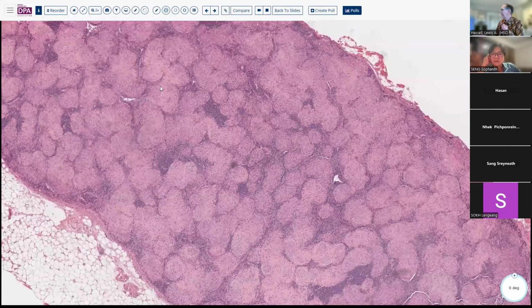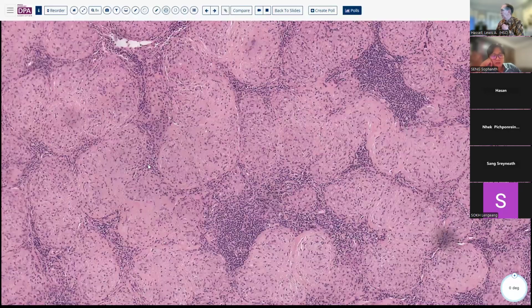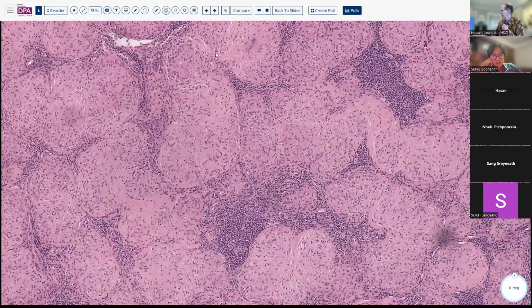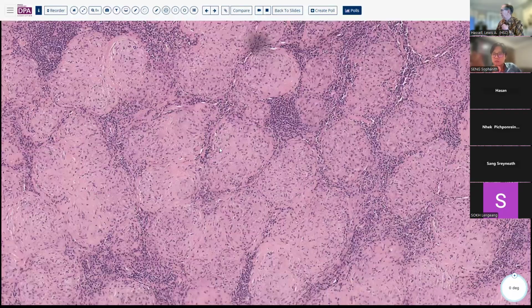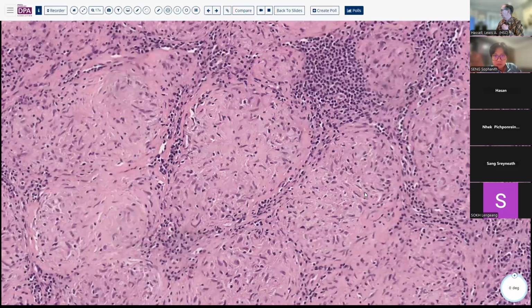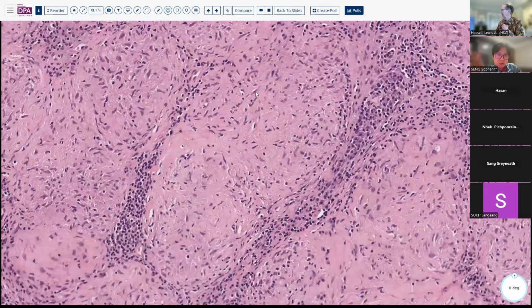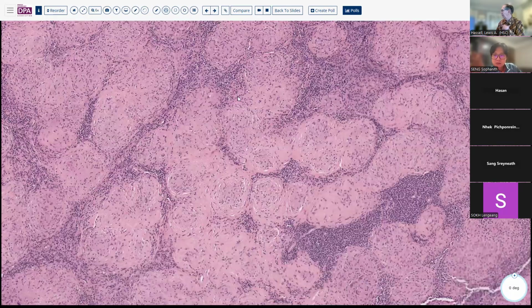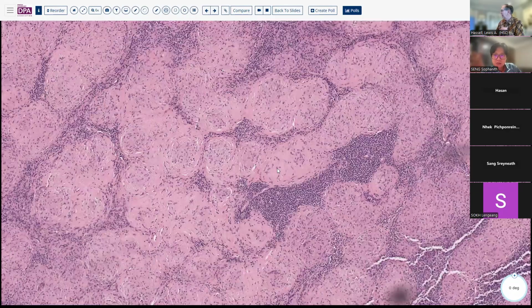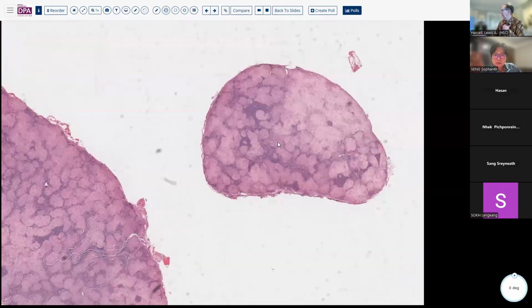Here you see these very nice, rounded, and quite tight non-necrotizing granulomas. There may be occasional giant cells in these granulomas, and there, of course, are other features like asteroid bodies and so forth, which can be seen but are not always present. And I looked quite a bit here and I could not find any. But we do have the nice non-caseating, non-necrotizing granulomas here in the lymph node that are obviously effacing the entire lymph node architecture in this particular case.